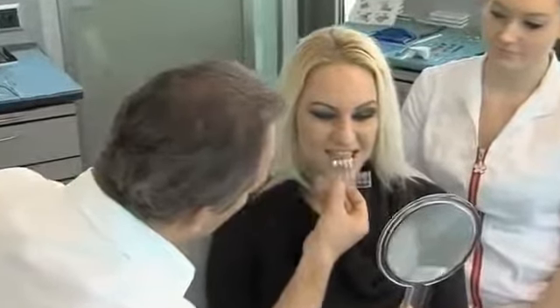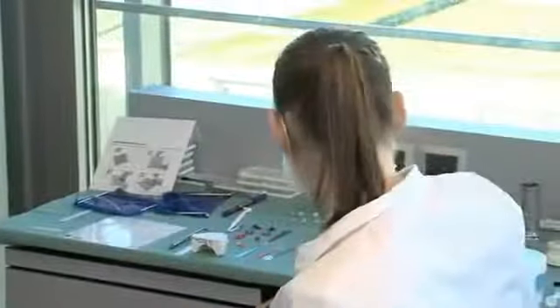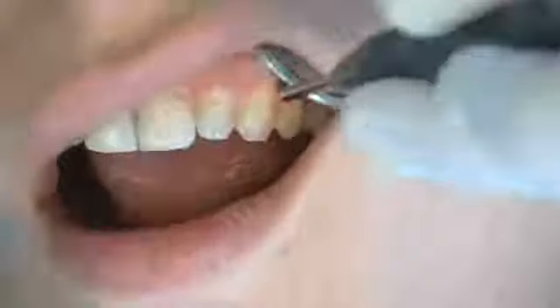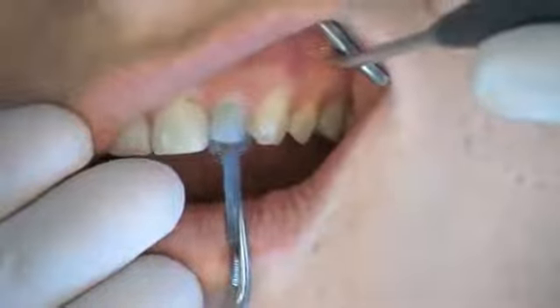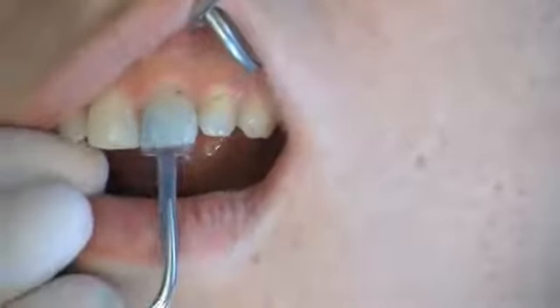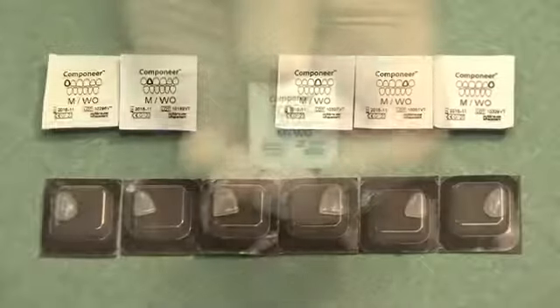A shade matching the brightness of the whites of the eyes will usually be found to be a close match. An acrylic stick aligned to the occlusion with dental wax simplifies the subsequent alignment of the occlusal plane to the facial symmetry. The shape and size of the Componeers to be placed can be determined by using the contour guide — the shapes match the corresponding Componeers perfectly.